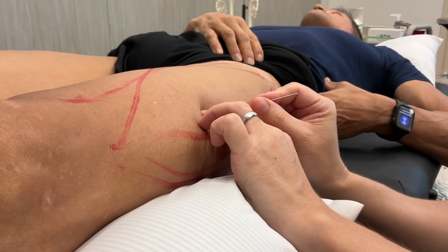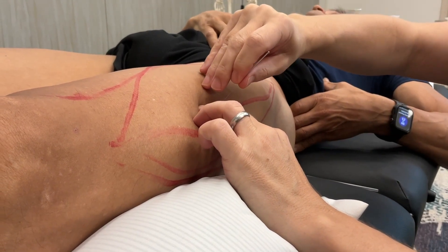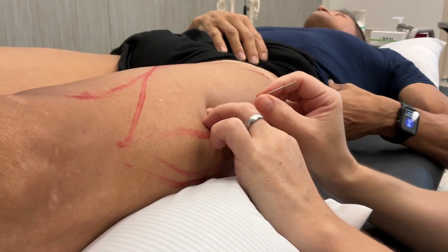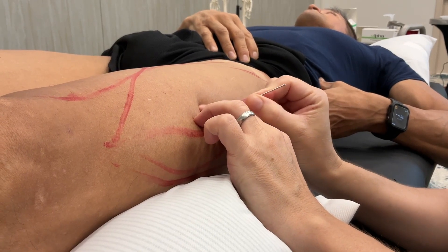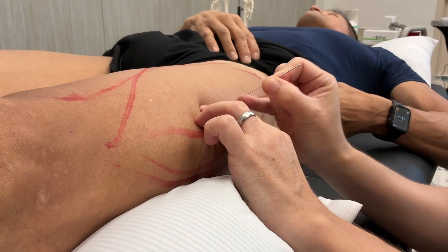Another one. See if you can see it. I'm in the bone here, so I'm going to withdraw a little bit and fan.